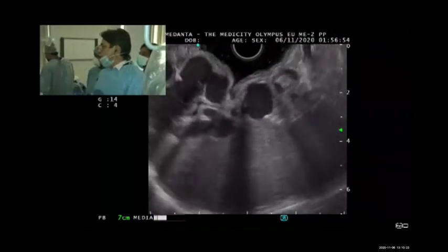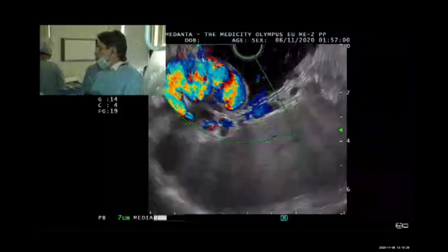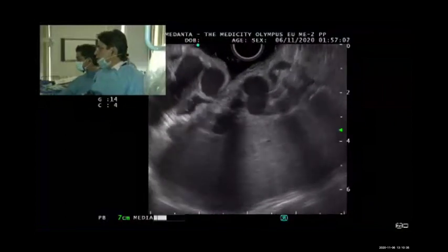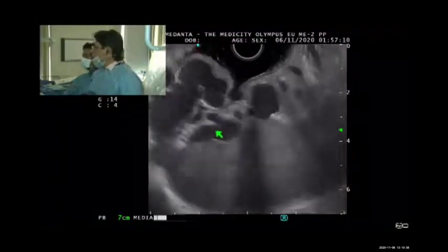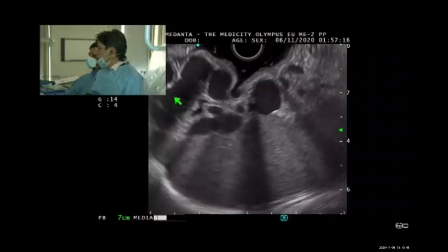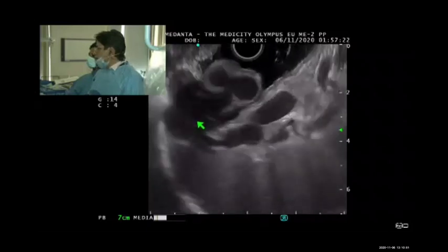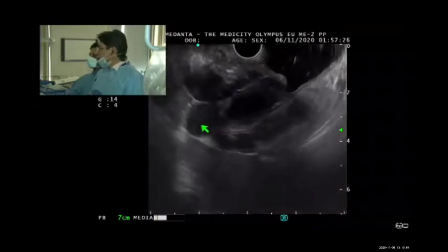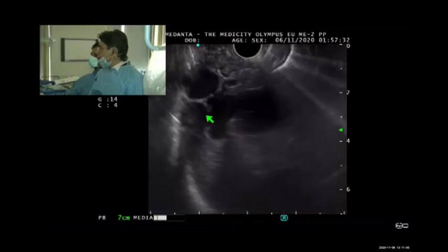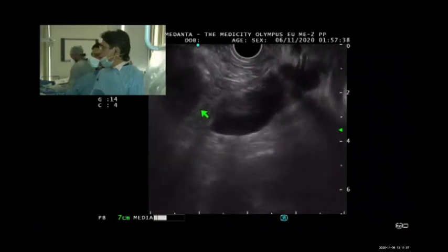Now, if I see the shunt, can you see now? This is the shunt. Can you show the shunt? Now you use the cursor. I'm just going to remove. Now you see that this is the large varix. This is the varix. And you look at, this is the shunt below. Yes, where the cursor is there. This is the shunt. If I follow this, can you see this is outside the muscularis propria? Can you see this is going towards the splenic vessel? Have you noticed? Yes. Is this okay?